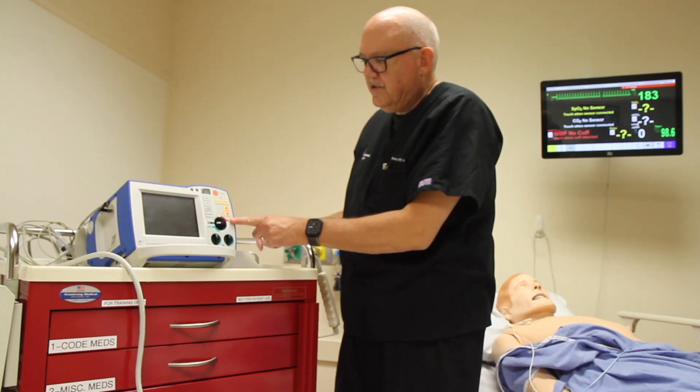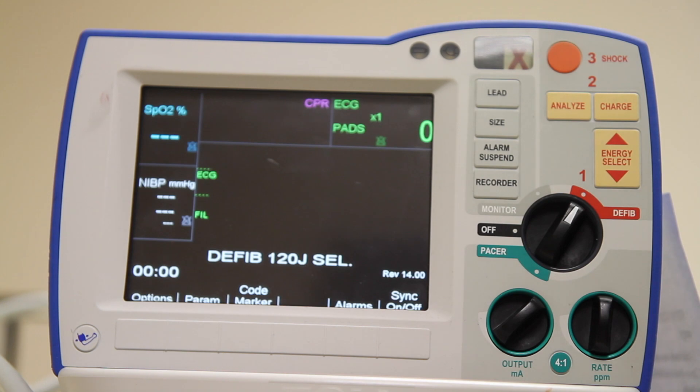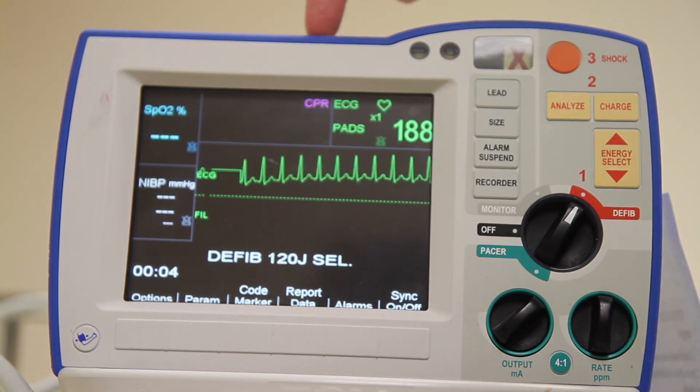Turn the unit on to step one, defibrillator mode. Confirm that you're looking at the lead that you want to be.